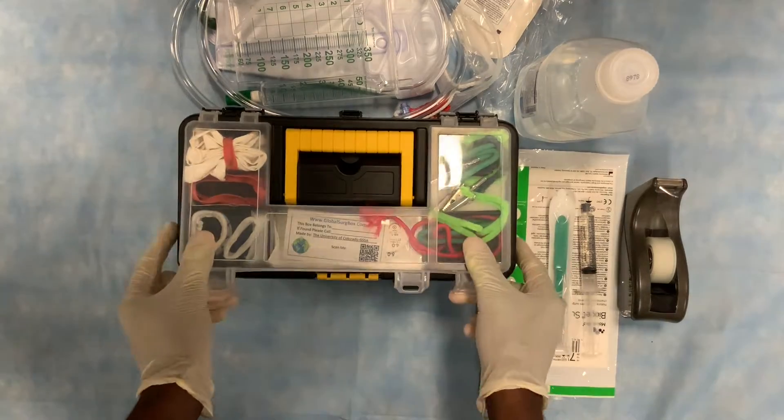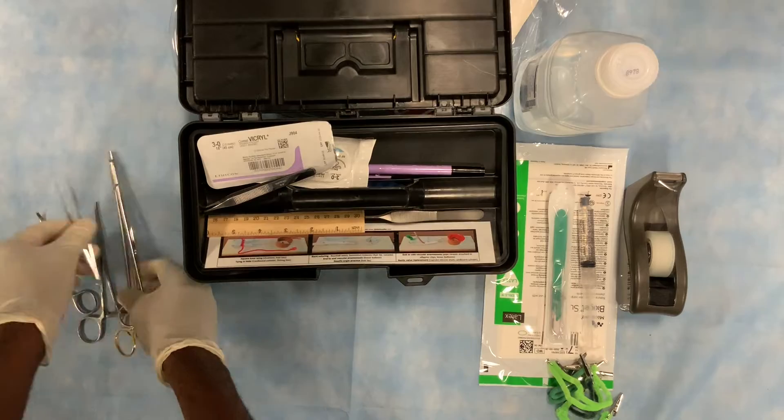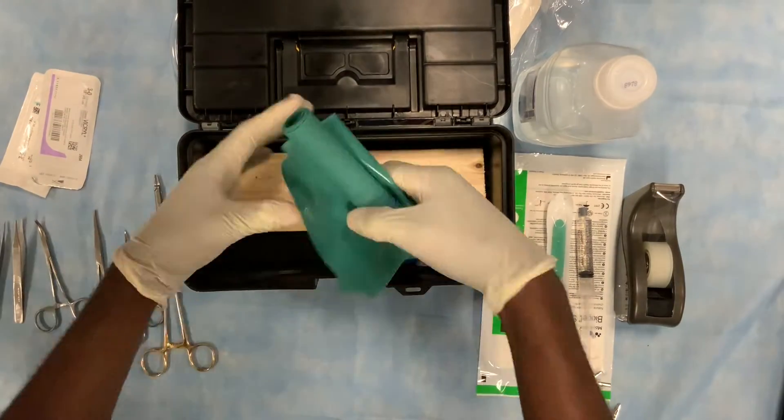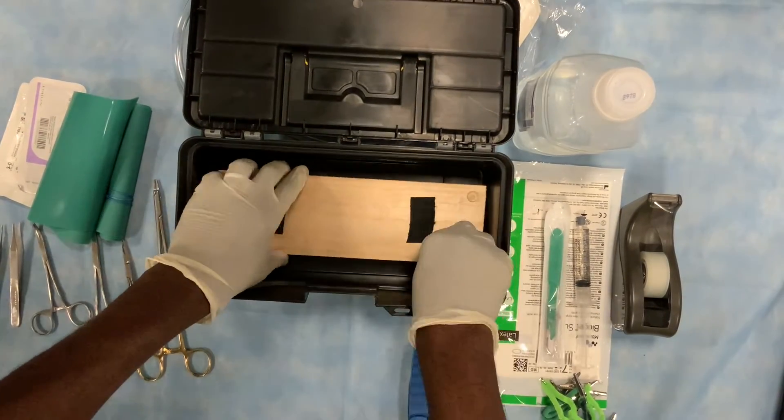The materials within the global surgery box you will need include metal clips, surgical instruments, suture, baking sheets, the flip-flop or sponge-like square, and the wooden board. These are all provided in the box.